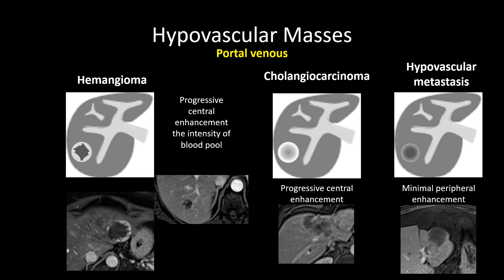In the portal venous phase, the hemangioma which showed peripheral nodular discontinuous enhancement may start to show more continuous enhancement, and the nodularity may be less apparent. However, it tends to remain peripheral, especially in the portal venous phase. In this smaller hemangioma we can see another nodule, so we still have that peripheral nodular enhancement. The enhancement should follow blood pool — we can see the IVC and the aorta, and the enhancing portions of the hemangioma are very similar in signal intensity to the aorta and IVC.